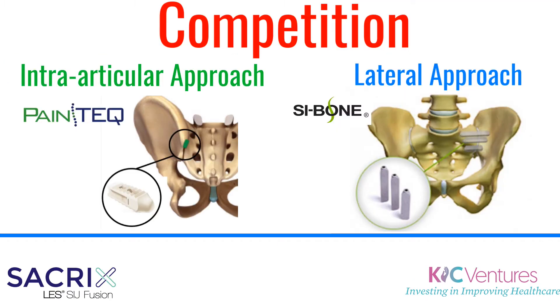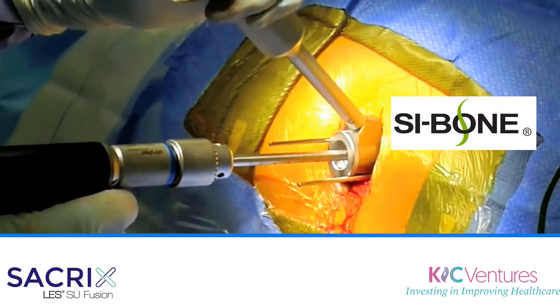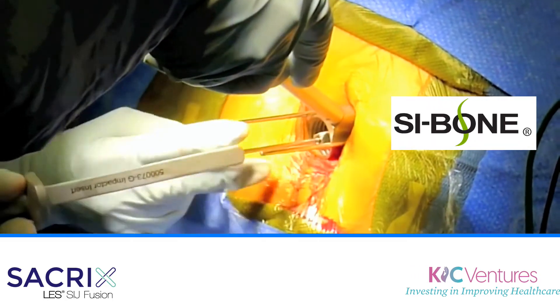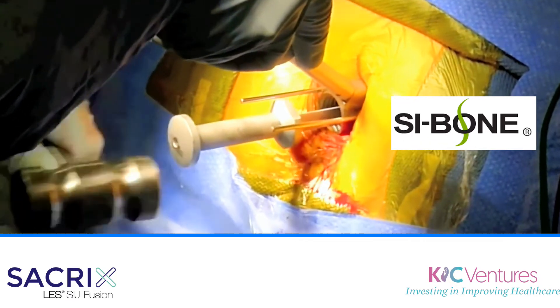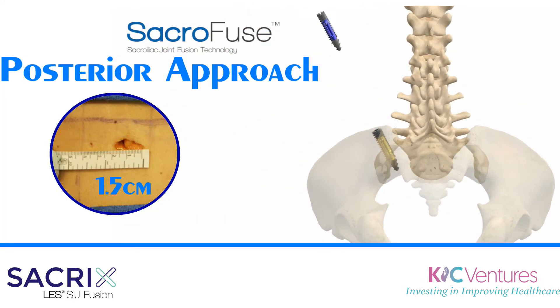The technique that's most widely used goes through a lateral incision about 6 inches. We are going to show you a new technique that goes posteriorly.